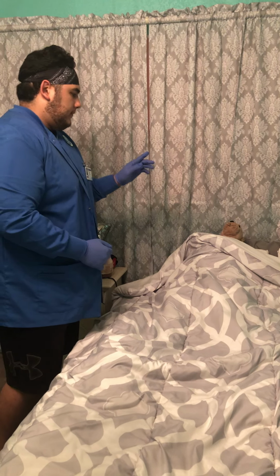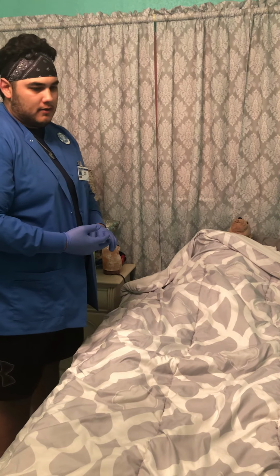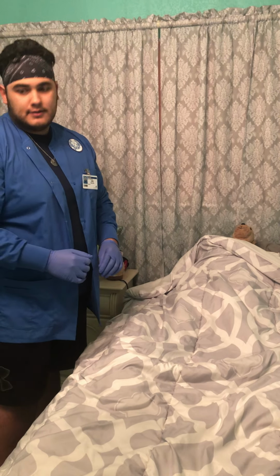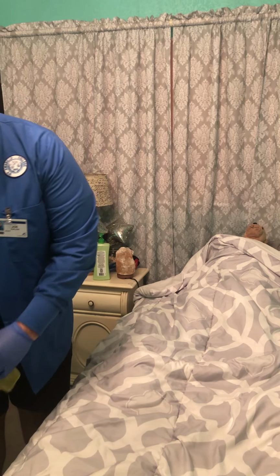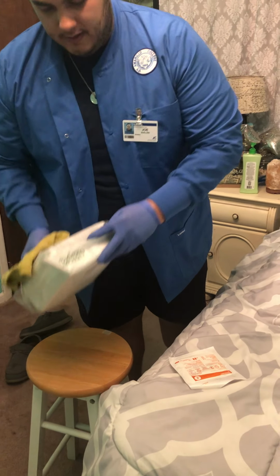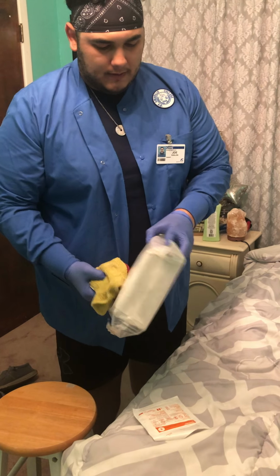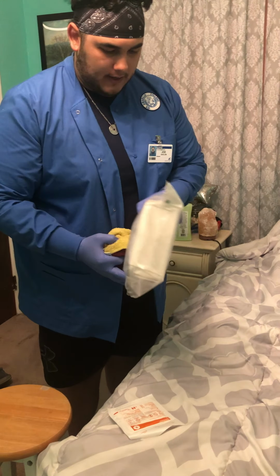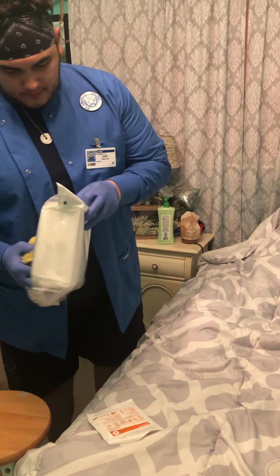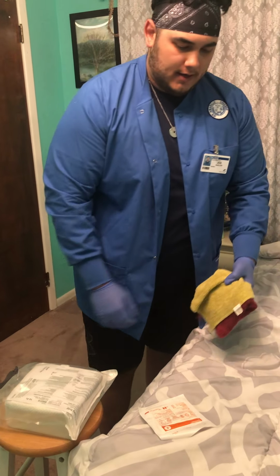And so once you've explained the process and everything and you've assessed the patient's bladder, you want to go ahead and gather all the supplies. So here I have a few washcloths, and I've got the foley catheter tray. Depending on what size is in here is what we're going to use today. So we're going to be going with the 14 French today.